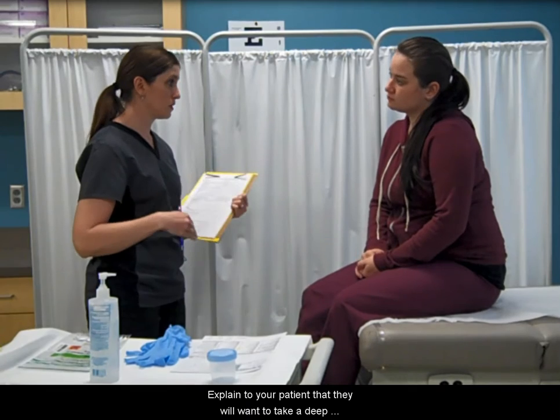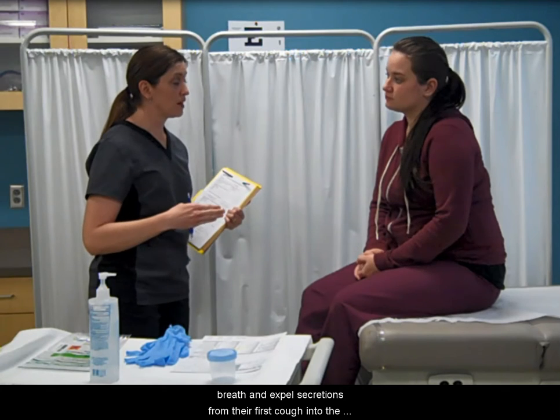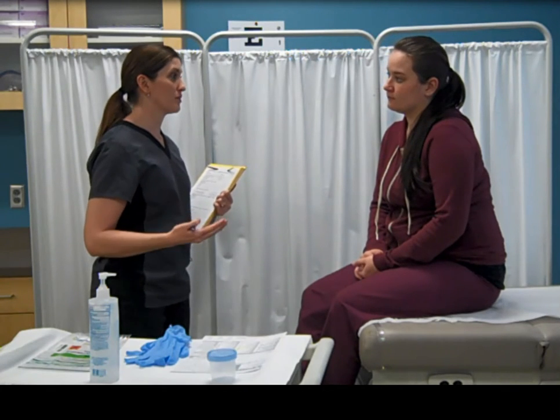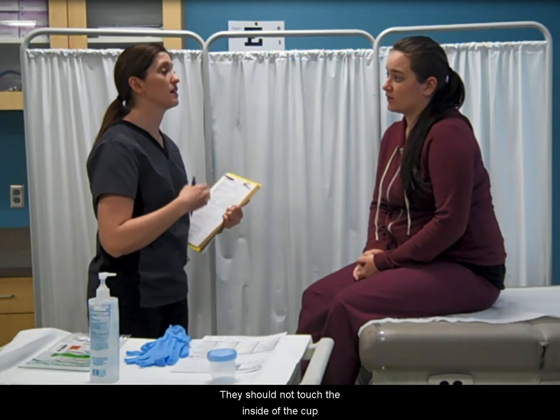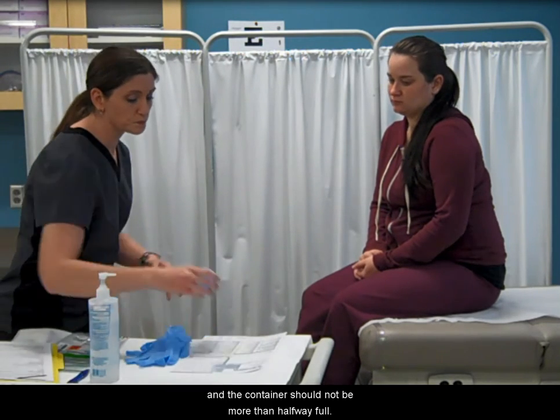Explain to your patient that they will want to take a deep breath and expel secretions from their first cough into the center of the cup. They should not touch the inside of the cup, and the container should not be more than halfway full.